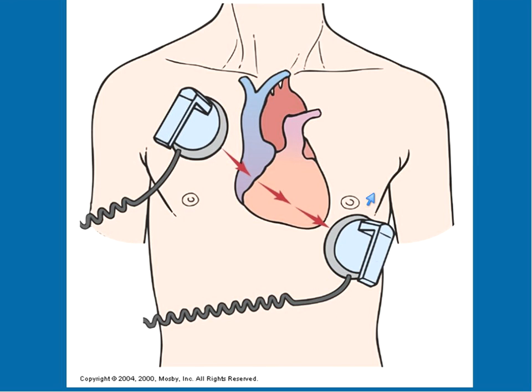When you put pads on a patient, you are going to push the defibrillator button from a machine off in the corner. When you use paddles, you defibrillate with a button that's actually on the paddles, so everybody can see, and if I'm the one holding these paddles down, I check to see that everybody's clear, and then I defibrillate. With the patches, pushing the defibrillator button happens up by the machine, so you have to be extremely considerate of your colleagues that might still be touching the bed, because you can give them quite a jolt and it can be dangerous.